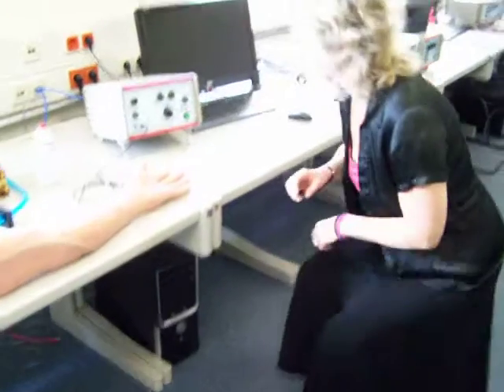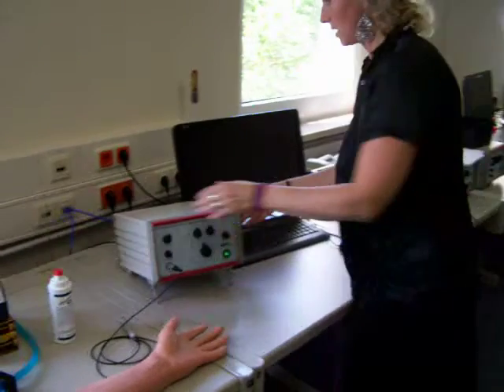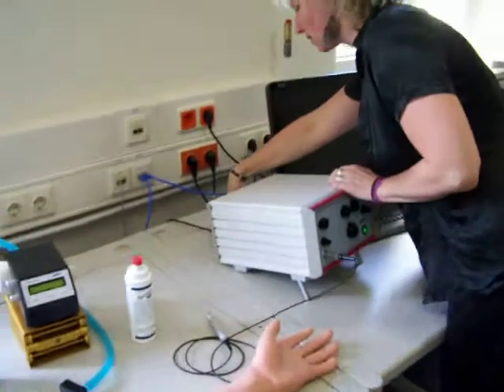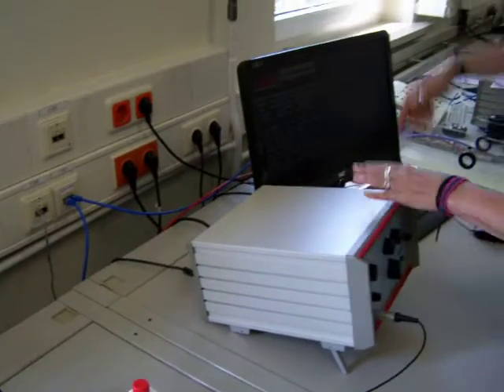Turn on the computer, turn on the device, and connect the device with the computer using a USB cable between the device and the computer.